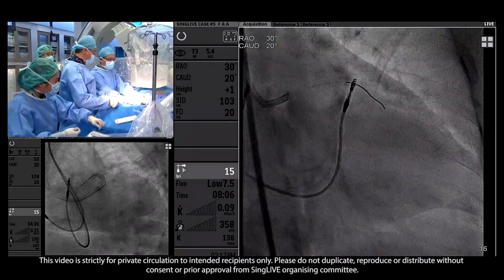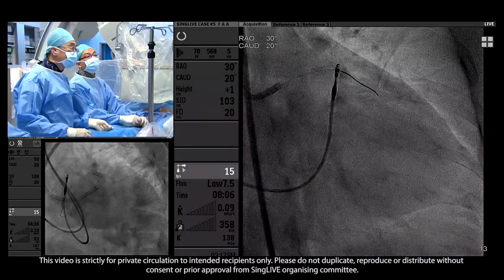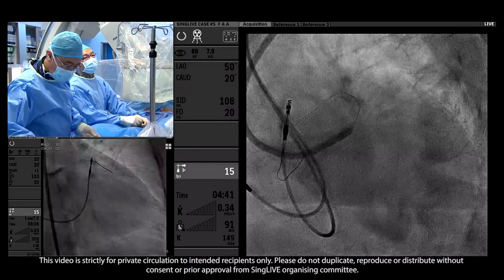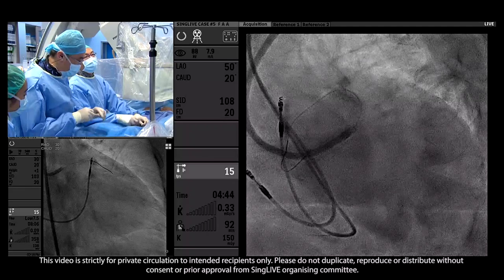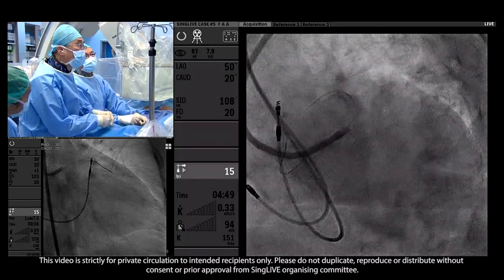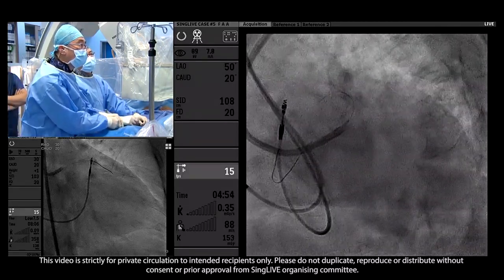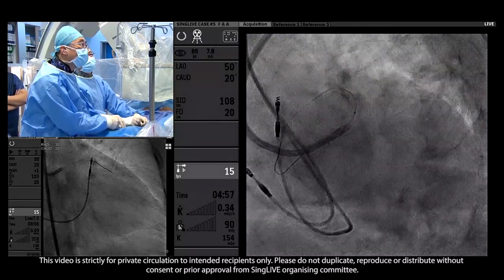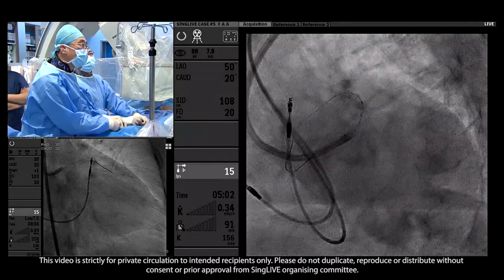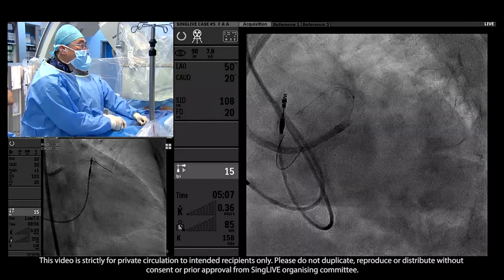Actually, in our center, we have a taper stent. We have quite some experience putting in a long stent like a 3.0 by 35, and then we can cover from the left main into the mid LAD, because the mid LAD can take something like a 3.0. Then the proximal part of the stent can be expanded up to 4.0 by the balloon. So if cost is an issue, we can use only one tapered stent from left main to the mid LAD. But if you really want to have a perfect result, then I think the strategy here is perfect, because we need the three stents.